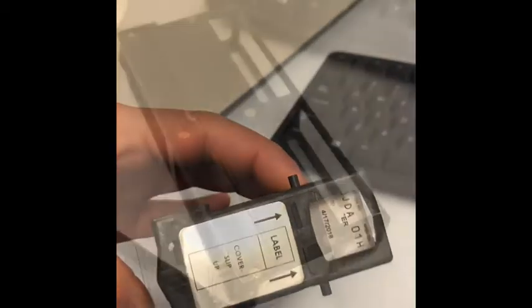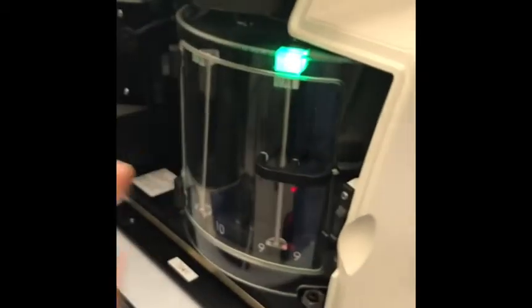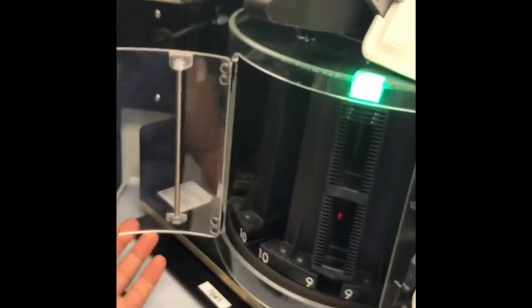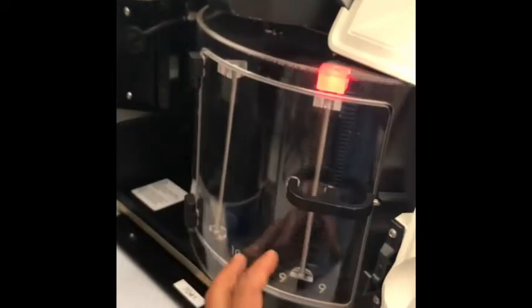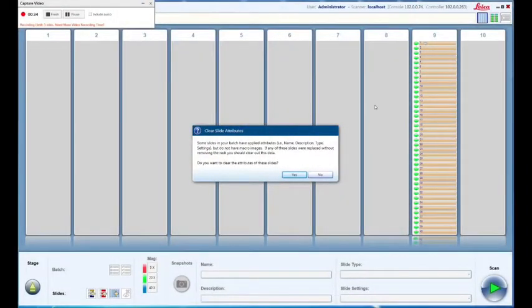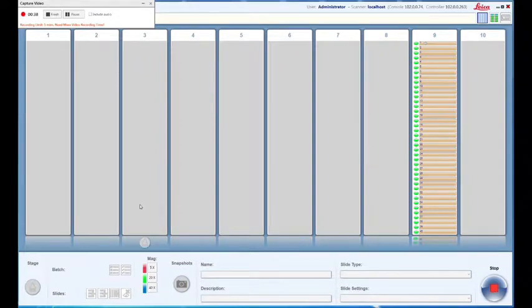After that, you will load it into the instrument by opening the door and placing it right below where the green slot is. As you close the door, it will turn red. Close the entire instrument and we'll bring you back to this page. Just click yes to clear the attributes.